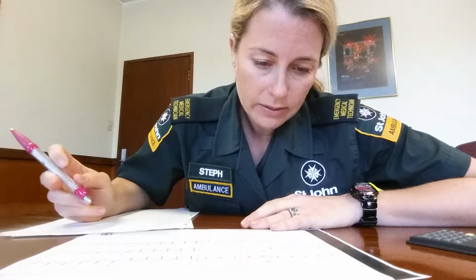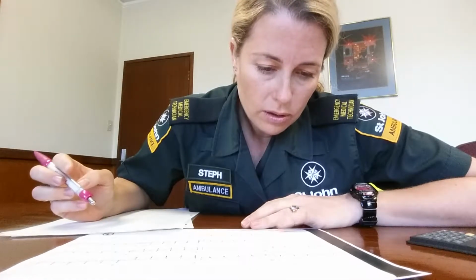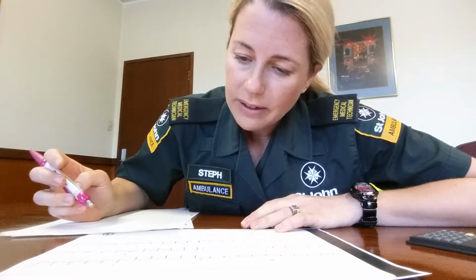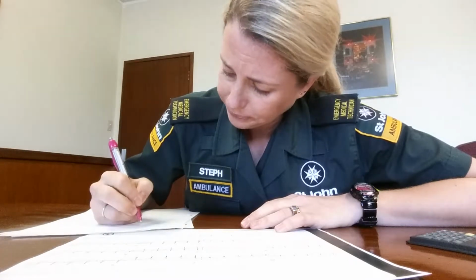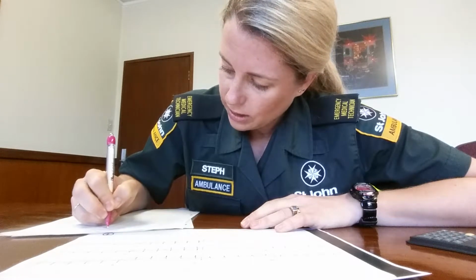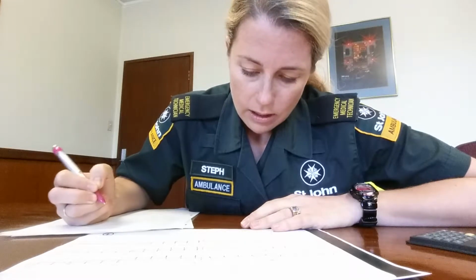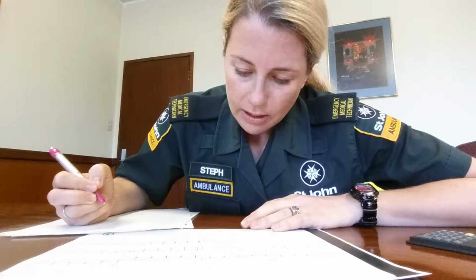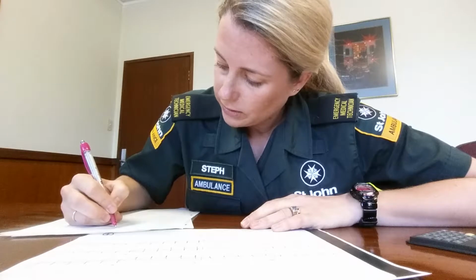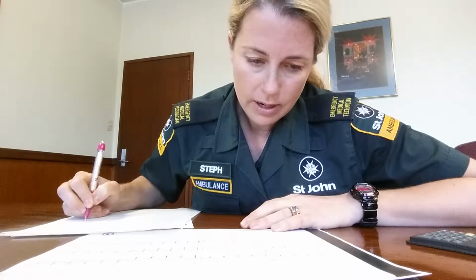Yes, I have P waves. They are symmetrical in 2, a bit biphasic in V1, so that is an intra-atrial conduction delay. But there is one for every QRS, so we're going sinus tachy for our rhythm.